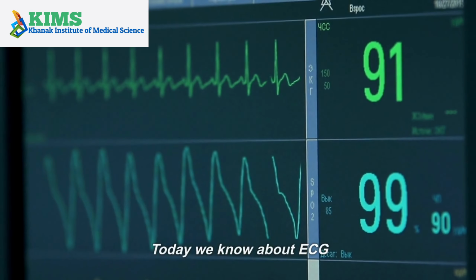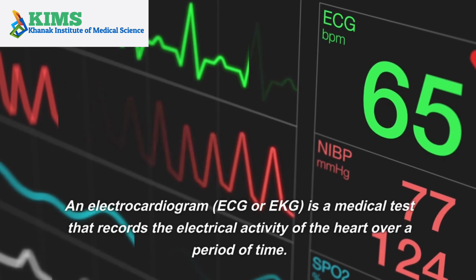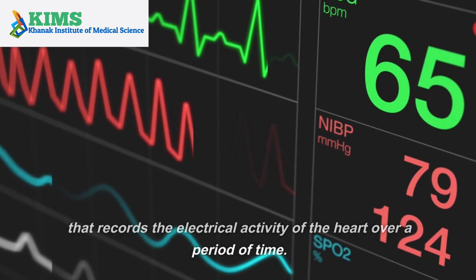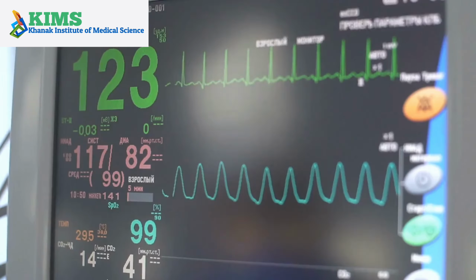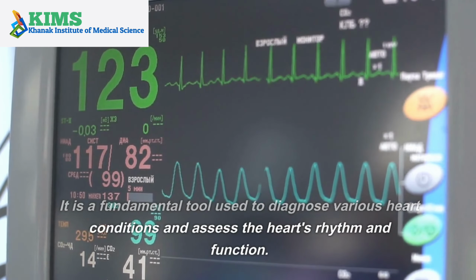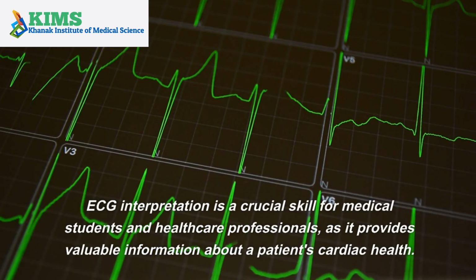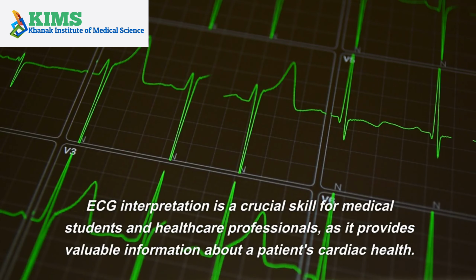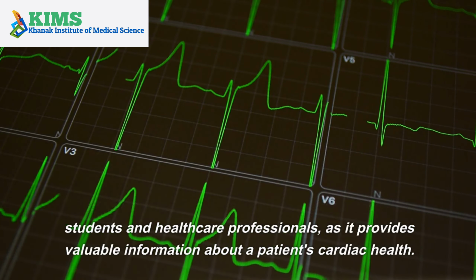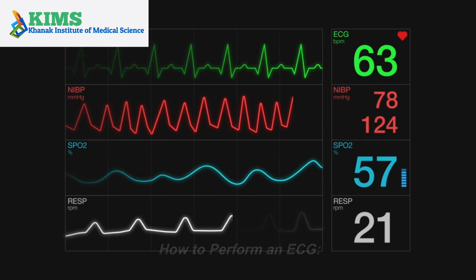Today we know about ECG. An electrocardiogram, ECG or EKG, is a medical test that records the electrical activity of the heart over a period of time. It is a fundamental tool used to diagnose various heart conditions and assess the heart's rhythm and function. ECG interpretation is a crucial skill for medical students and healthcare professionals, as it provides valuable information about a patient's cardiac health. How to perform an ECG?